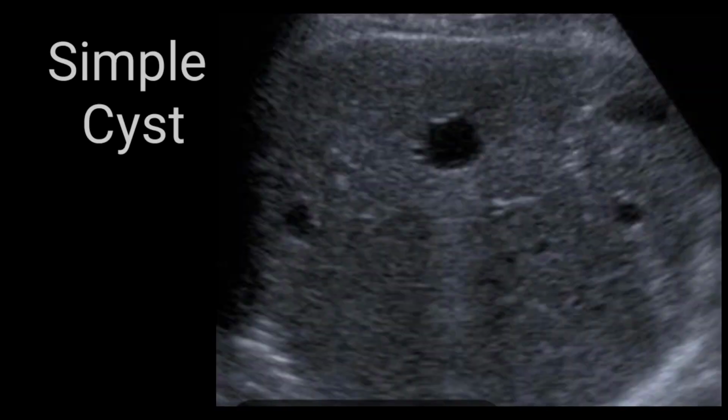Look at this image. This is a liver, and within the liver parenchyma, there are multiple cysts. The largest cyst should be less than 2 centimeters in size, but internally there is no echo. It's all simple cysts. But keeping in view that there are multiple cysts, always look at the kidney, because in von Hippel-Lindau disease, there is likely a possibility you may have multiple cysts in other organs of the body as well.